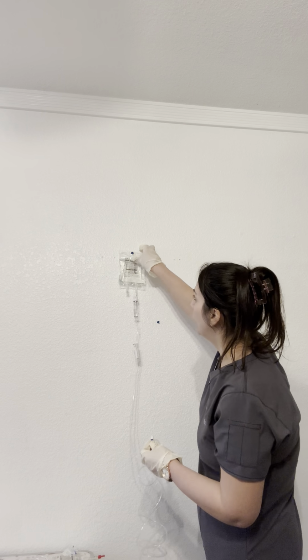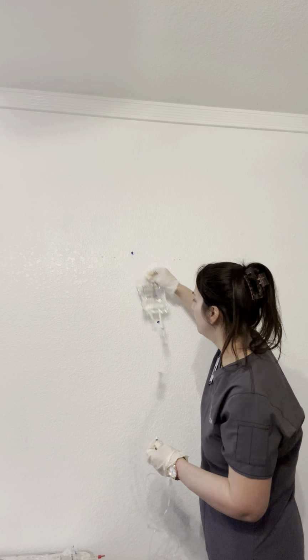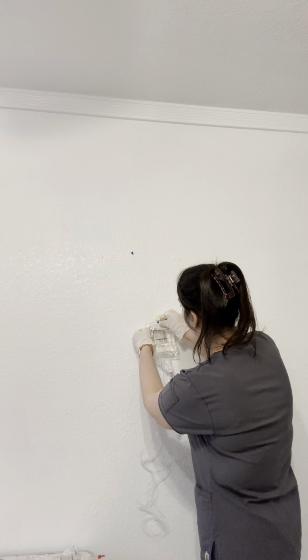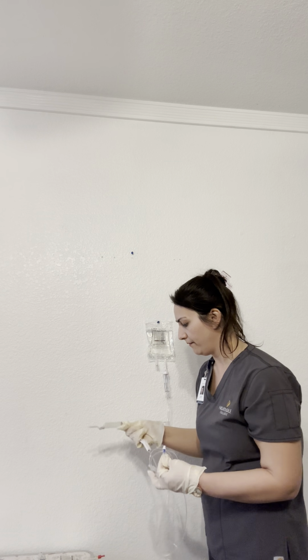Next, we're going to bring this down because the patient needs amoxicillin. And if I need to, I'll re-alcohol that. And we're going to connect the piggyback chamber.